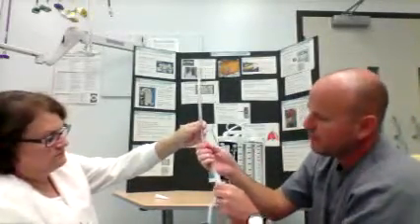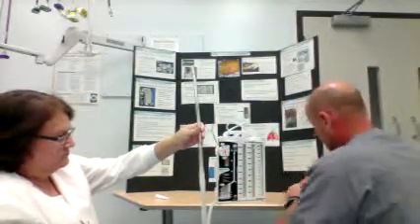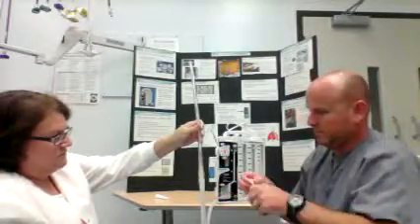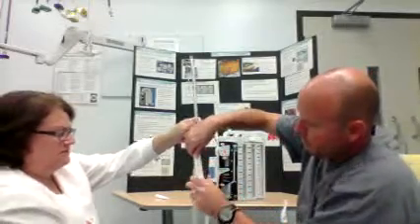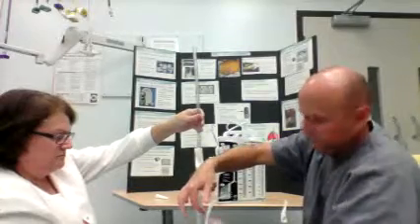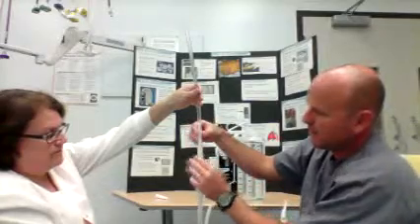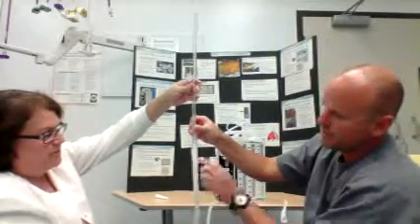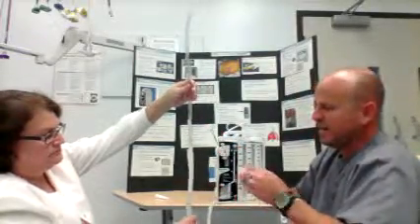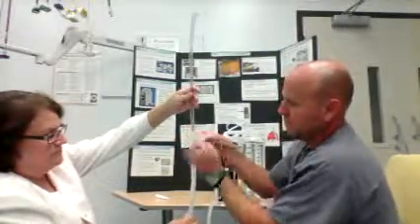So the preferred method of taping a chest tube and securing it, if you could hold that for me, Deb, is to do one long strip, lengthways. Hold it up a little higher. There we go. So you want to do a long strip, kind of wrap it around your tubing like this. That way, this side you can still completely see. You're not occluded whatsoever. Then, around each side, you just do your wrap like this.